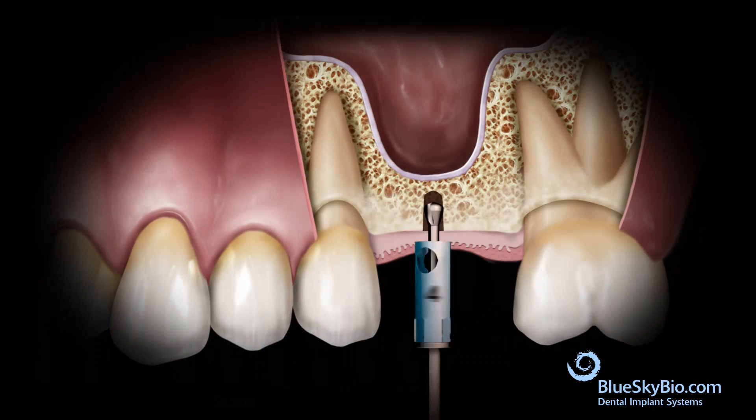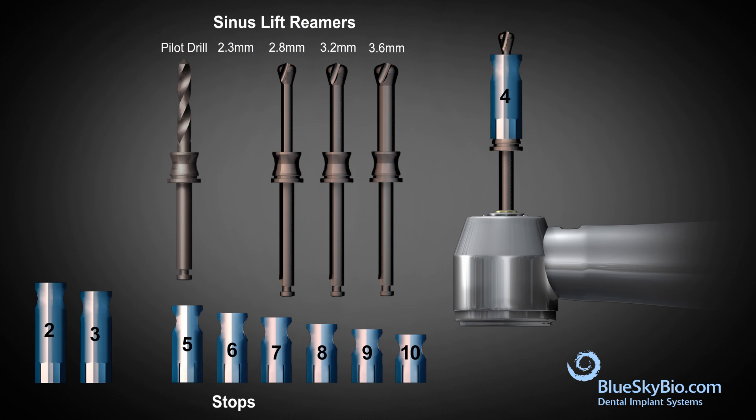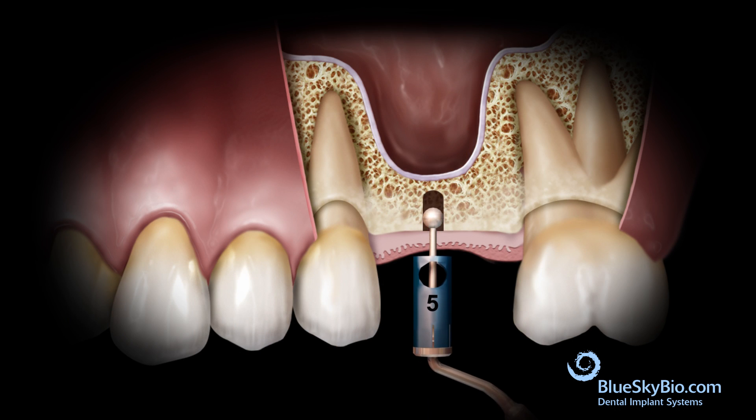The drill is inserted until the stop touches the cortical bone. A stop that increases the length by one millimeter is placed on the probe, and the probe is inserted into the osteotomy. If the stop is above the bone crest and the probe cannot advance, the sinus floor has not been lifted.